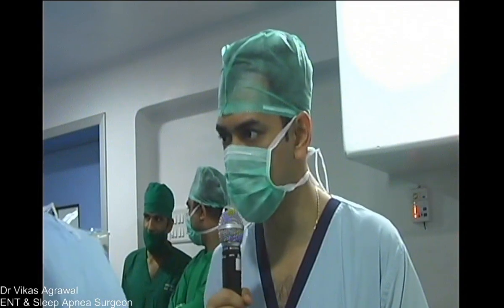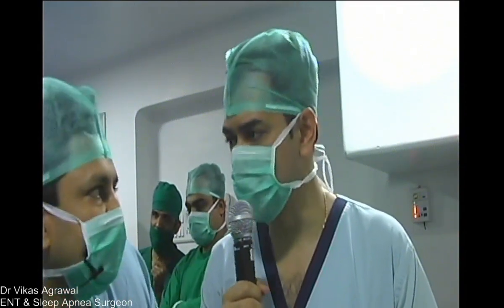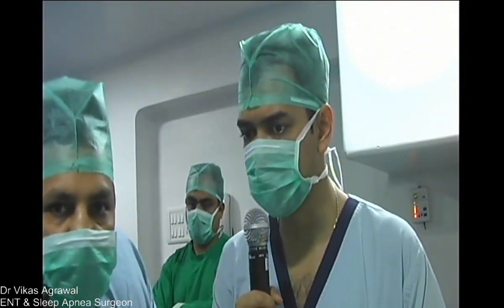The challenge here is that it is a conscious sedation, and the challenge is to replicate natural sleep as far as possible so that you get a very natural picture while doing a drug-induced sleep endoscopy.